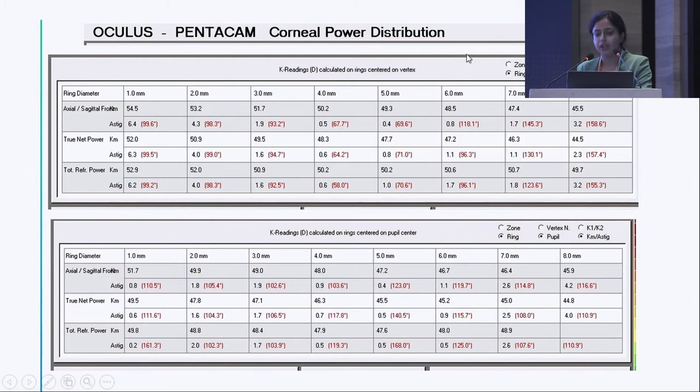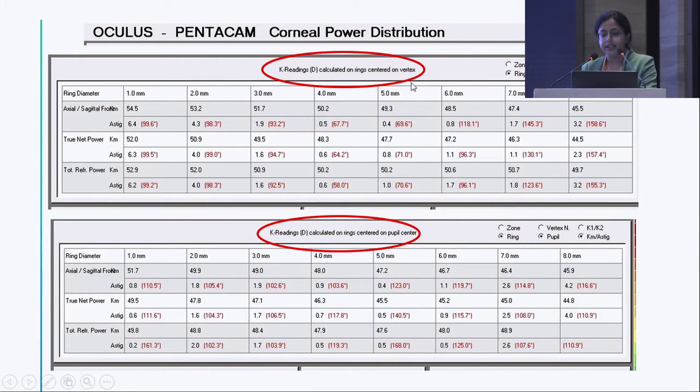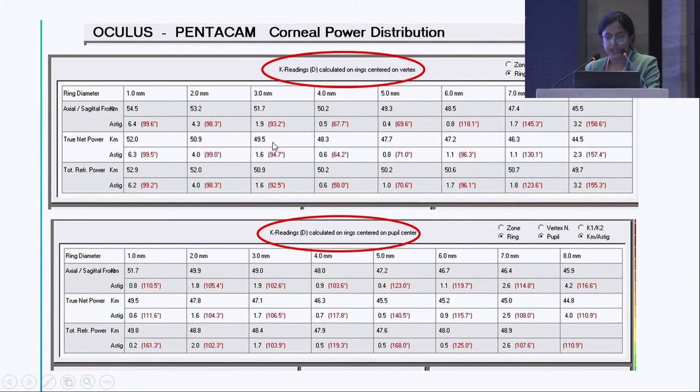This is a corneal power distribution map — same patient, same eye. Readings centered on the vertex versus centered on the pupil differ significantly. For example, the true net power at around 3 mm is 49.5 D when centered on the vertex and 47.1 D when centered on the pupil. You need to use more pupil-centric powers in keratoconus, as the K is lower, and post-op hyperopia will be reduced when using these pupil-centric readings.